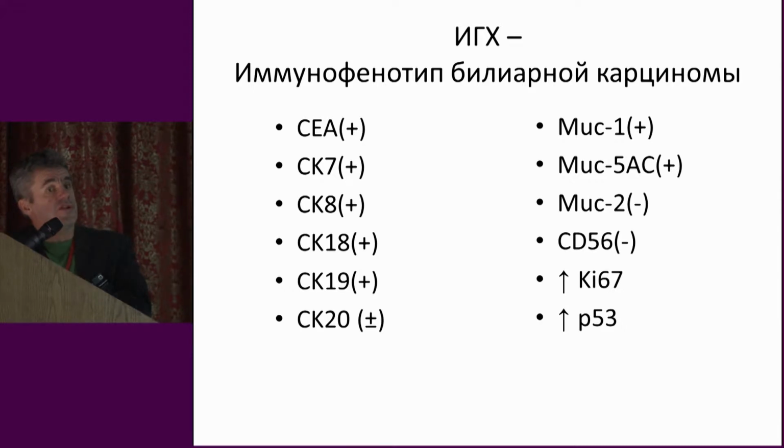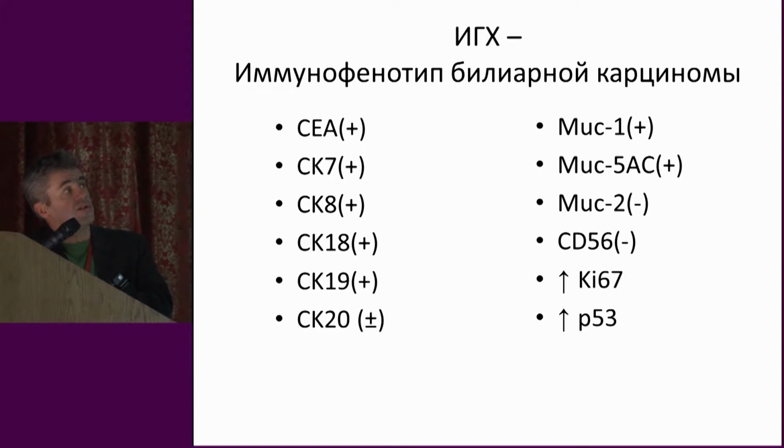It's clear that for us to find out the type of epithelium and its functional activity, we can use immunohistochemistry. And for differentiation of intrabiliary changes, we can use a cytokeratin panel. You see different mucins to understand which type of epithelial rearrangement we have in place.